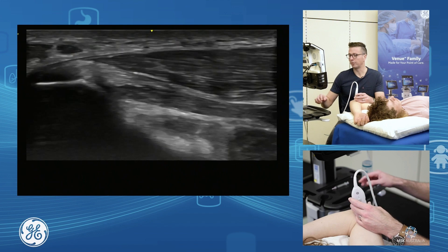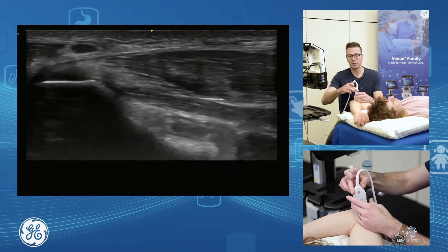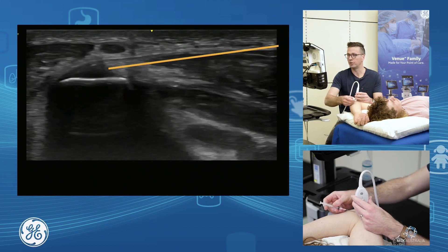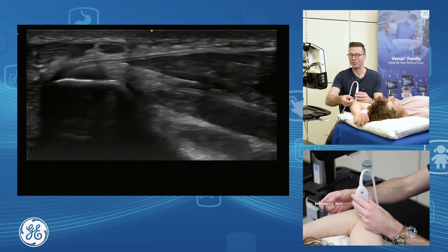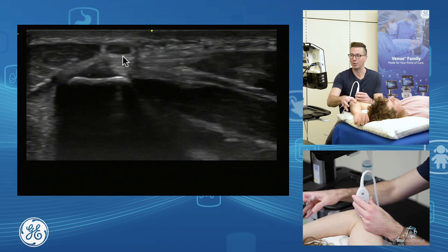To inject the common flexor, I come up in through here and bring my needle in to inject. The key thing to be aware of is the ulnar nerve. In this position the patient's ulnar nerve is sitting right on top, so you want to try not to hit that when you're injecting.